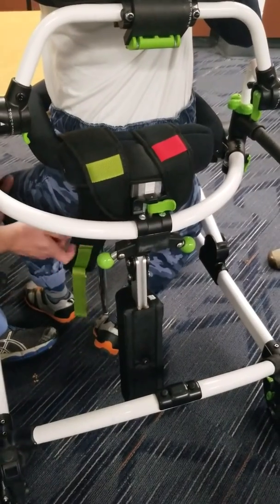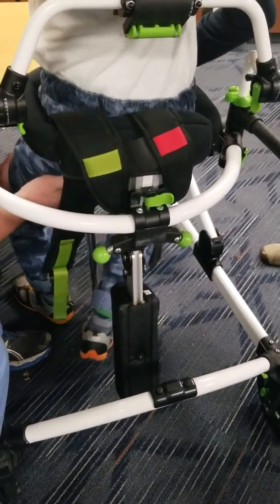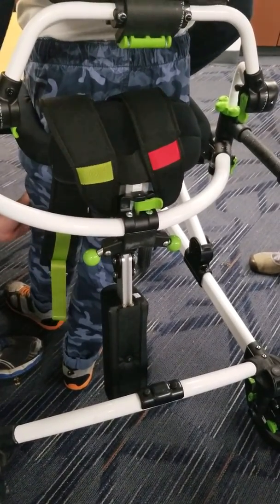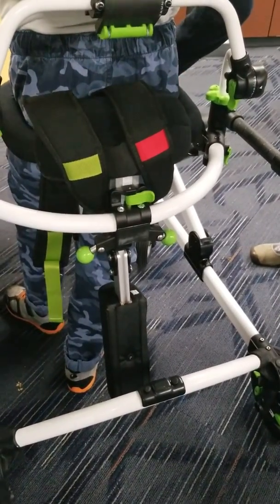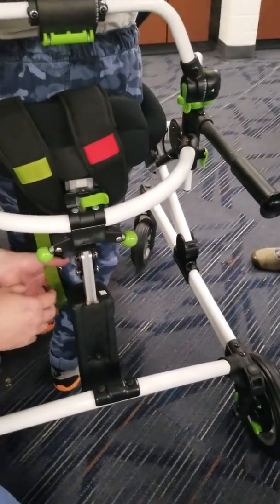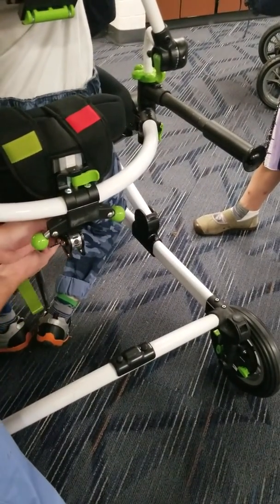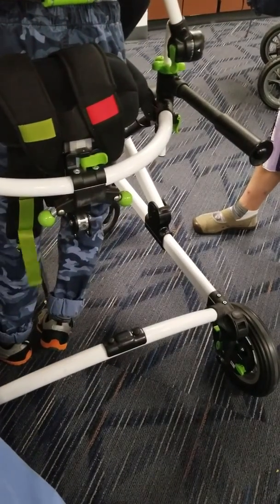So if he was like this, then I would either help here and then say, okay, Ruffin, let's stand up. And then just put a little, nothing really hard, just a little bit of pressure here. And then sometimes we'll shift his weight to try and make his legs a little even for a little more stability. But if it was for a longer period of time, or if he was starting to get tired, there you go. This can be an extra stop as well.